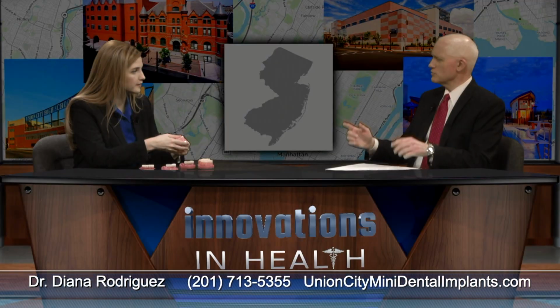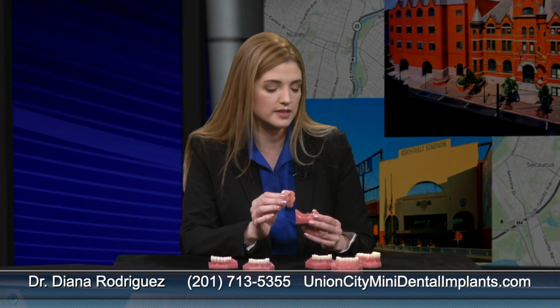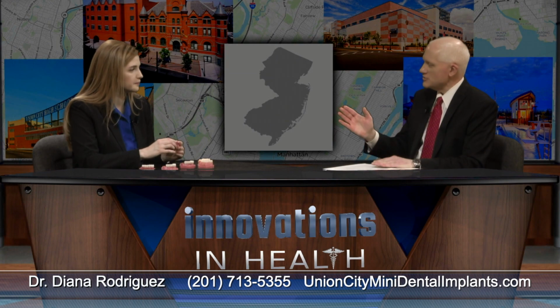So the patient should really understand that this is something that's going to last. This is not going to slip out. Right. The O-rings do have to be replaced approximately once a year. The patient may feel that the denture is not fitting as tight, in which case they come in, and that's something that we do right in the office. We can just pop these O-rings out and pop new ones in. Part of the general routine maintenance. Exactly. In addition to the cleaning. Right. So that's the denture.